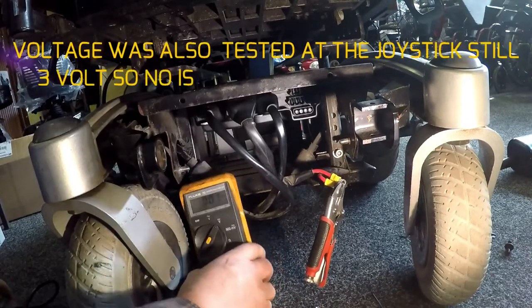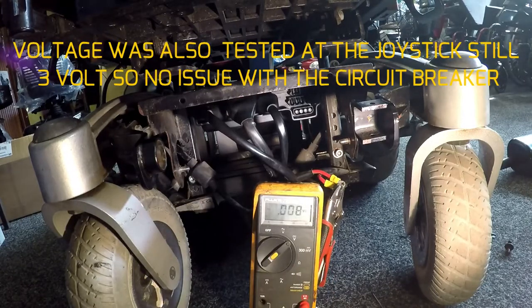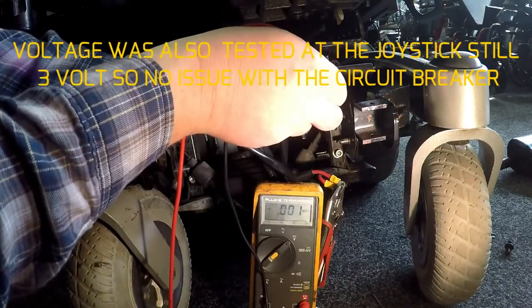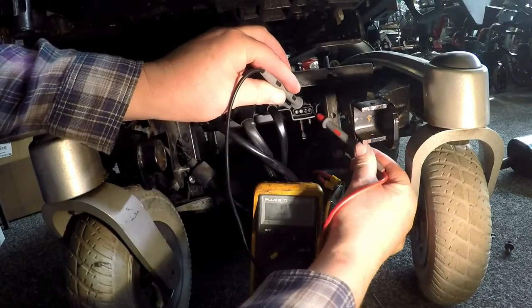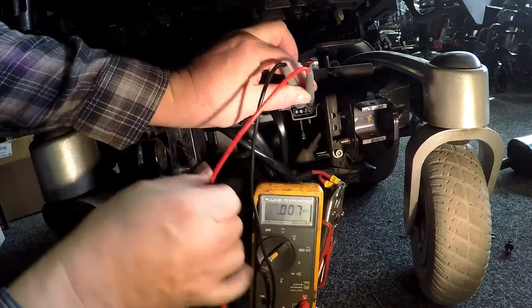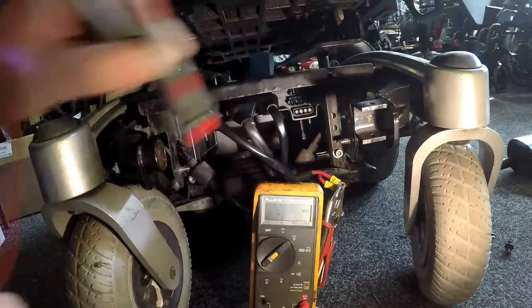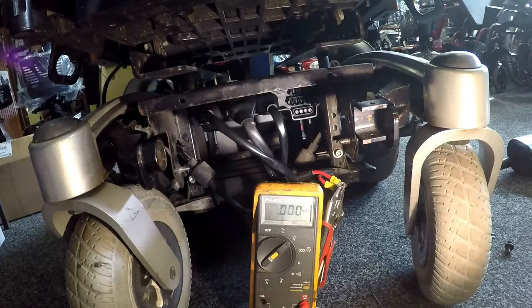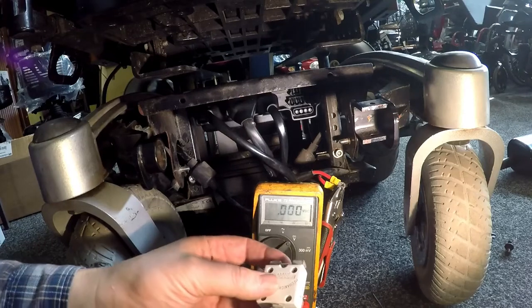The voltmeter here — positive and negative. Alright, so we're still getting 24 volts when I'm holding it in here. 24 volts. So as I said, there could be a problem with this, but now that we've joined them together, let's just try the joystick. I think the issue is somewhere else — it's not the circuit breaker that's causing the issue. So let's go and have a look.